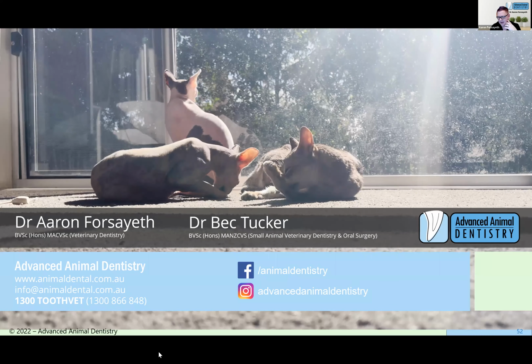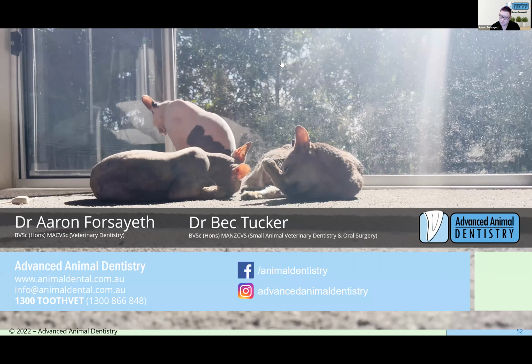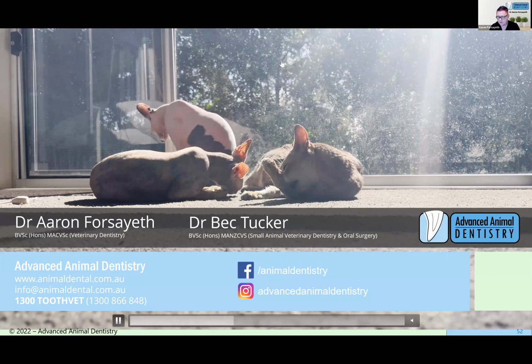As that last slide touched on, we believe it's about understanding the fundamentals of how an image is produced. And if you know how it's produced, you can adapt yourself to wherever you are. Here's a show-off moment. If you're x-raying a polar bear that's lying down on the floor and you can't move it, you can get a correct image because you know where your plate is, you know roughly where the axis of the tooth is, and you can work it all out.